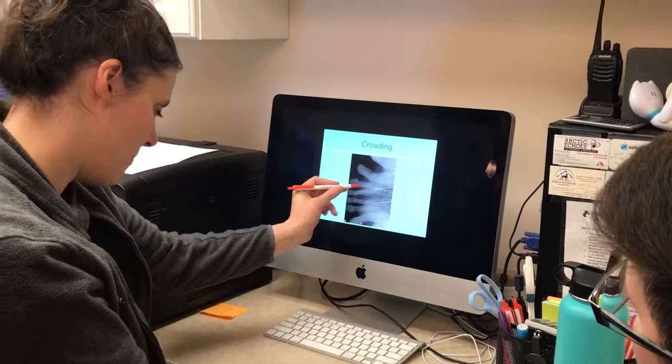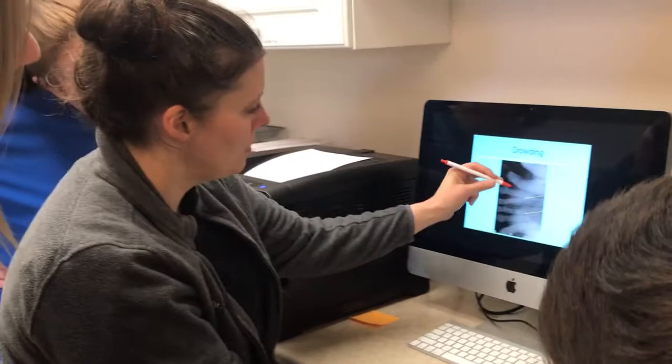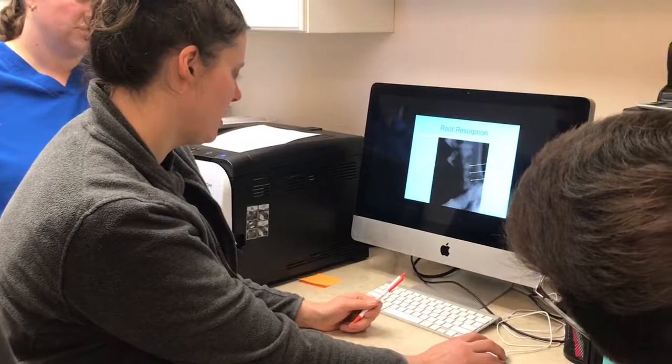In this one, the teeth are really crowded and overlapping. There's a kind of speckly pattern to the bone here, which probably indicates infection. The bone should come all the way up to the neck of the tooth but it's been eaten away — probably tartar has pushed it down. Especially here, you can see the bone is way down when it should be much higher. That's likely from periodontal disease.